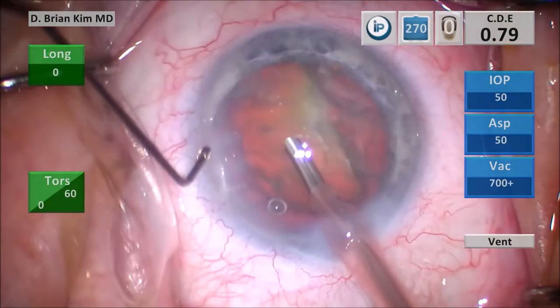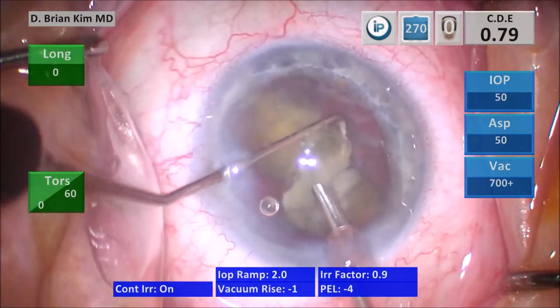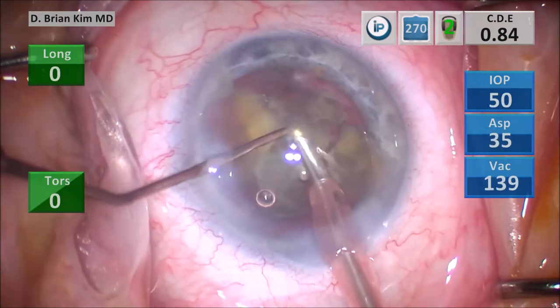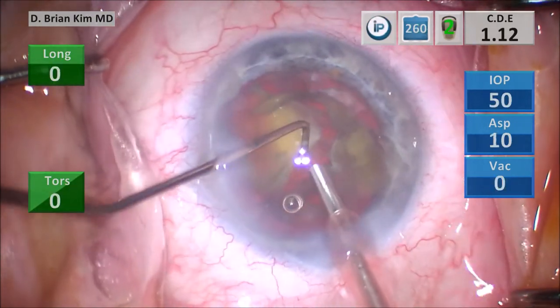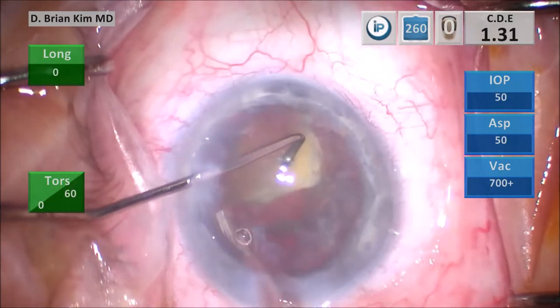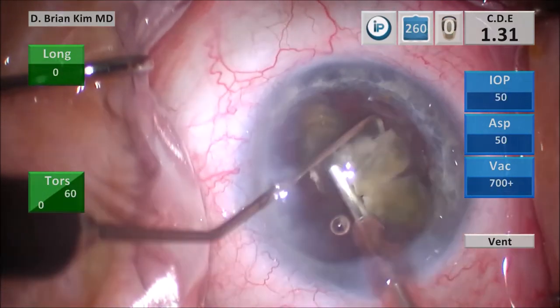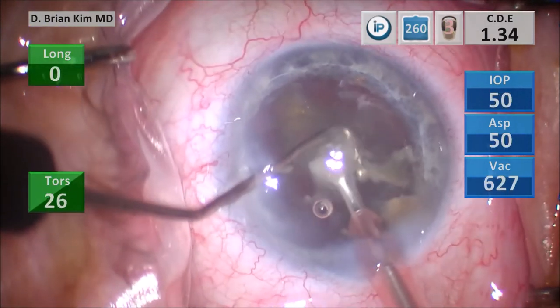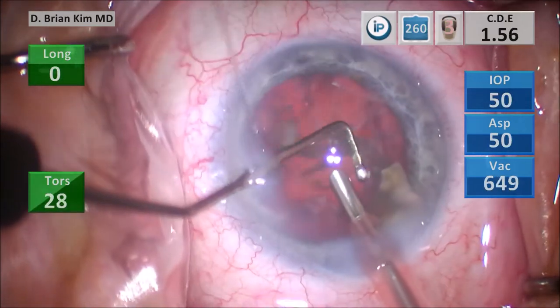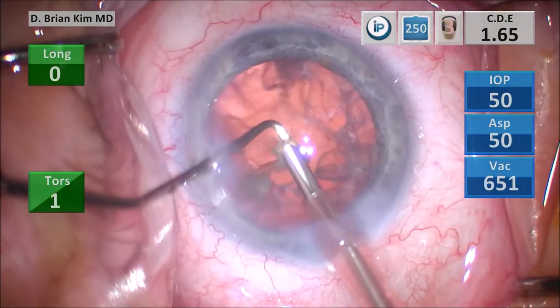I go in with the chopper and the phaco tip, and since the lens is mobile now, I just reposition it under irrigation only, crushing it using mechanical fracturing forces. Positioning the instruments between the lens material, crushing it into smaller pieces, then emulsifying. There is quite a bit of density to this lens. Positioning the lens under irrigation, sandwiching the lens piece between the chopper and the phaco tip, and once the pieces are smaller, initiating some vacuum to position and crush even more, then emulsifying. That's the final piece of endonucleus — crushing it into smaller pieces and then emulsifying.